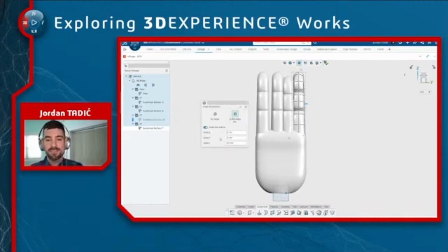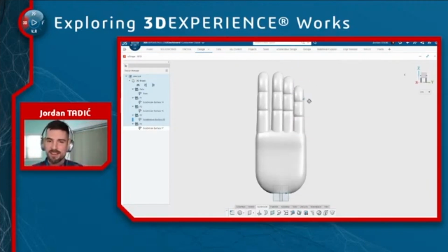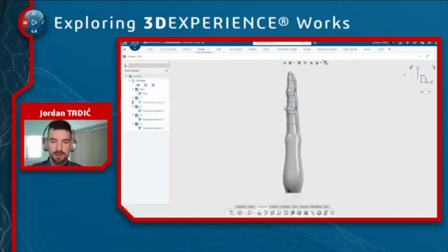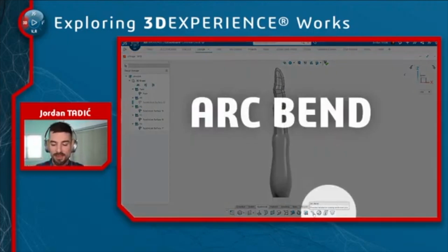So that means if I'm editing something in an ordered geometrical set at the top of my design tree, then if I'm doing some editing up there, I could still see all the other ordered geometrical sets that were created downstream. So it's kind of like an in-context assembly design mode without the burden of creating a bunch of separate parts and giving them part names and dealing with the data management stuff. So for conceptual design, this is also a great way to make multiple variations.